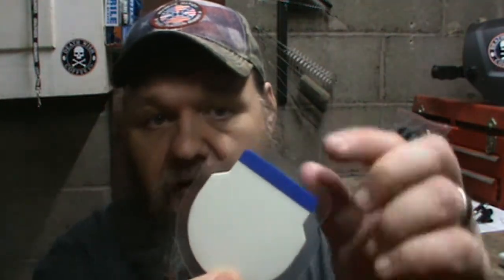Here's what it looks like. You have one blue side and one side that's not got blue. It's just all white when you peel it off. There's a little confusion I see in some of the groups I belong to and some of the regular public forums that I go to, of what goes to what.